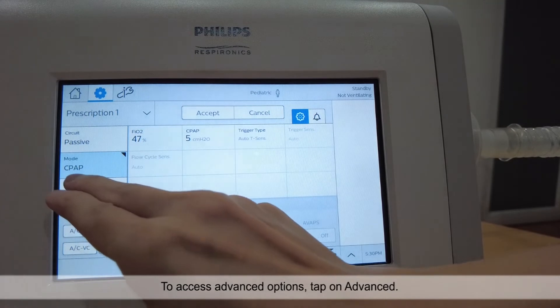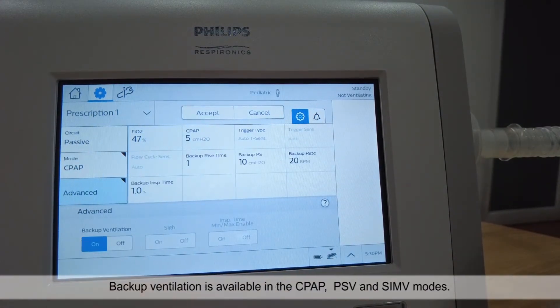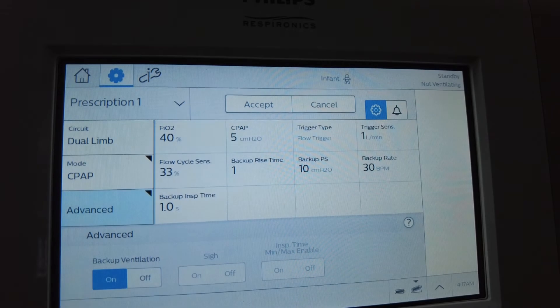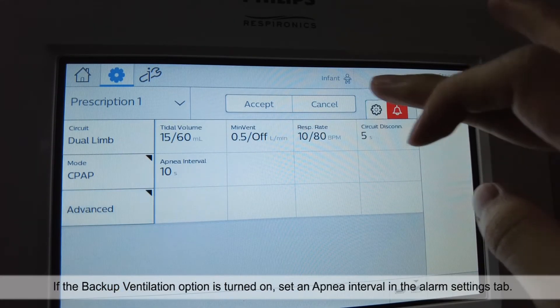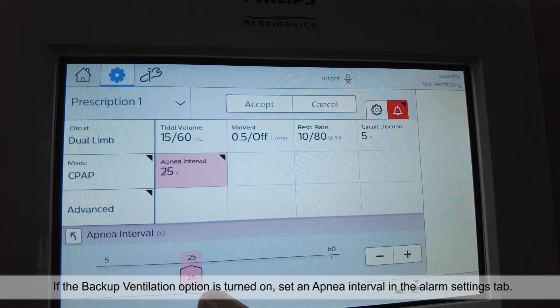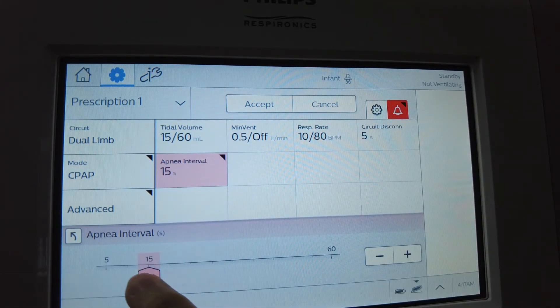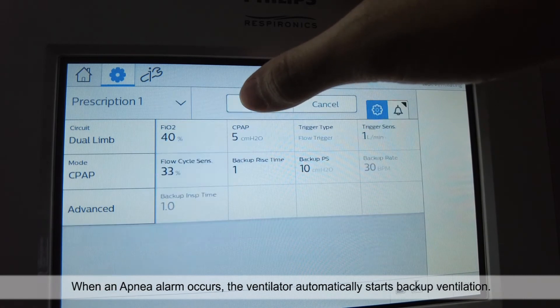To access advanced options, tap on advanced. Backup ventilation is available in the CPAP, PSV and SIMV modes. If the backup ventilation option is turned on, set an apnea interval in the alarm settings tab. When an apnea alarm occurs, the ventilator automatically starts backup ventilation.